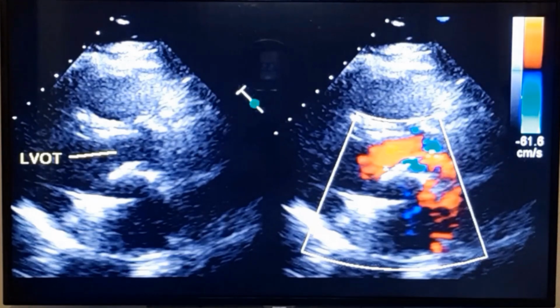So a post-operative echocardiogram is to be there and you have to be comparing it at a regular interval so that you will know whether the gradients are increasing, whether the changes are occurring. So serial echocardiograms are very important in the evaluation of prosthetic valves.